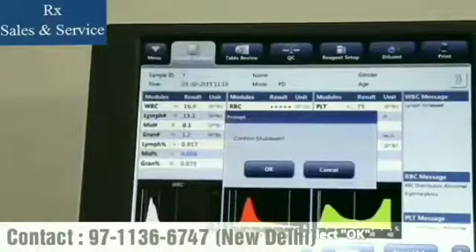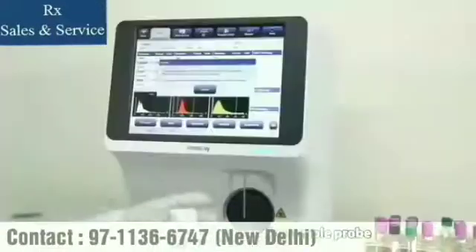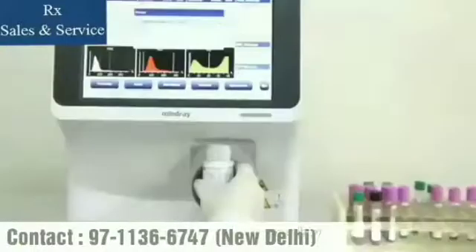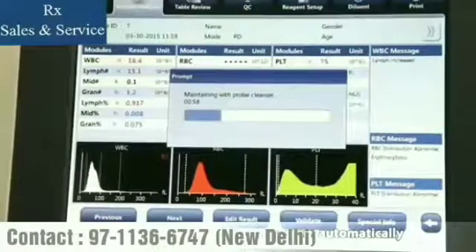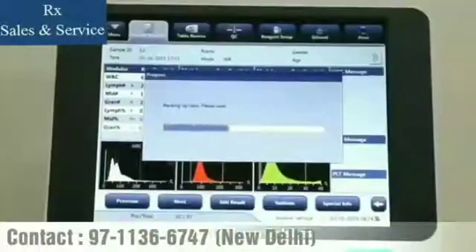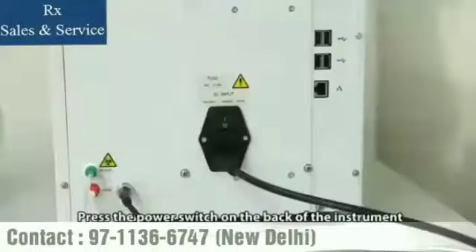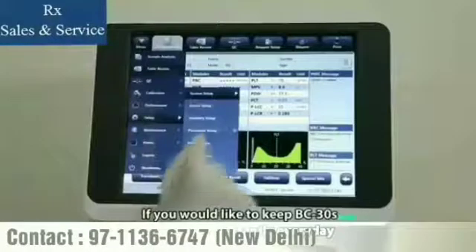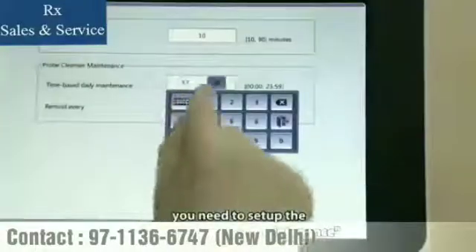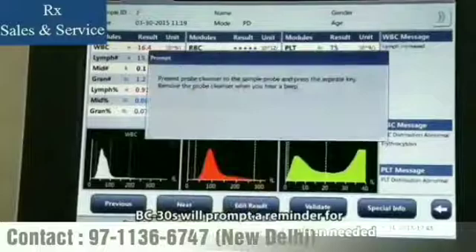Click the Shutdown button and select OK. When the dialog box prompting probe cleanser maintenance is displayed, present the probe cleanser to the sample probe and press the aspirate key. The probe will aspirate the probe cleanser, and BC-30S will clean the whole system automatically. After shutdown finishes, the message 'Please turn off the power of the analyzer' will be displayed — press the power switch on the back of the instrument to power off. If you would like to keep BC-30S turned on constantly every day, set up the time-based daily maintenance. BC-30S will prompt a reminder for probe cleanser maintenance when needed.